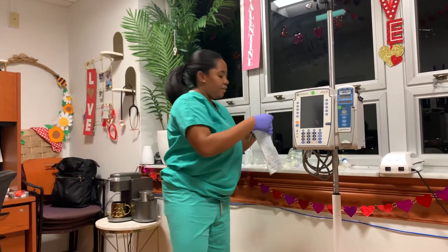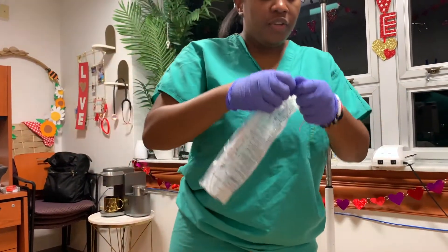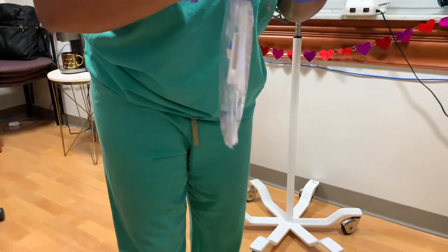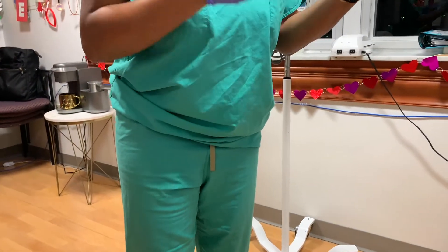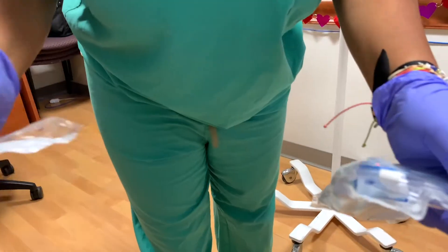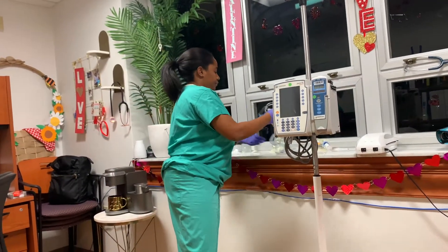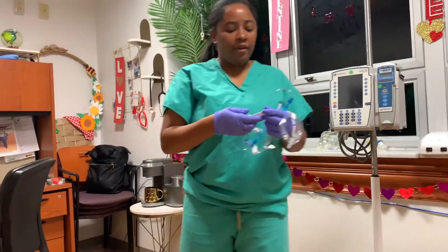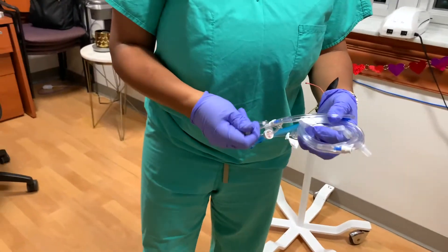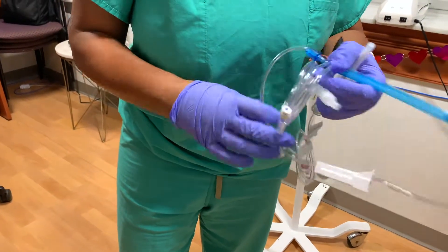So now what I am going to do is go ahead and open up my package for my line. Usually they have a little slit on the side so we are able to just go ahead and open it — we can just tear that open, which makes it a lot easier. We have to be very careful when we are about to prime. We just want to make sure that everything is clamped, that way we do not make a mess and we do not waste any medication.